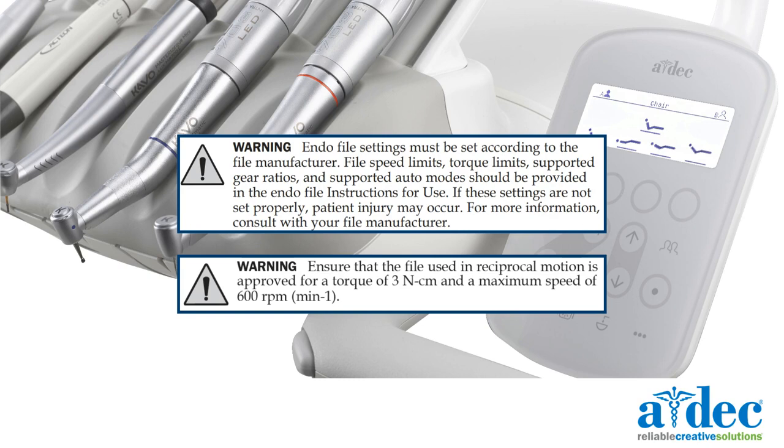Ensure that the file used in reciprocal motion is approved for a torque of 3 Newton-centimeter and a maximum speed of 600 revolutions per minute.